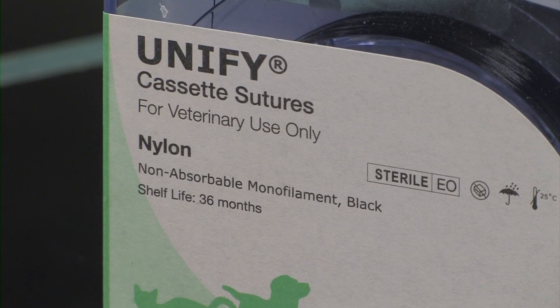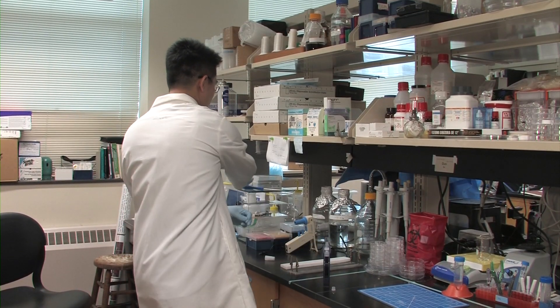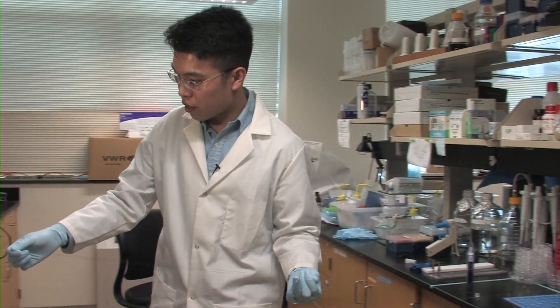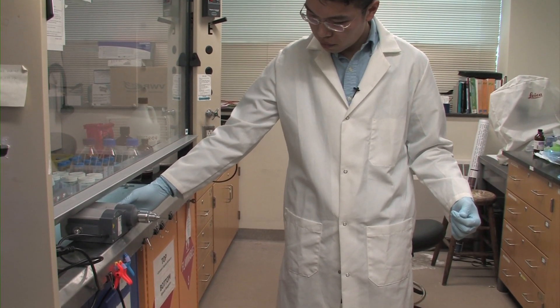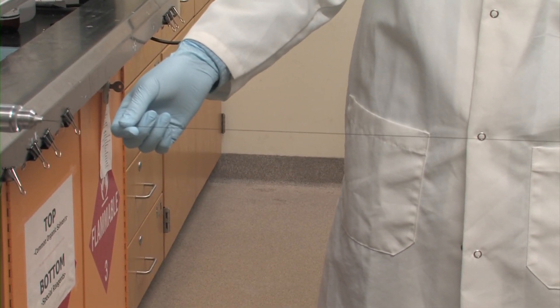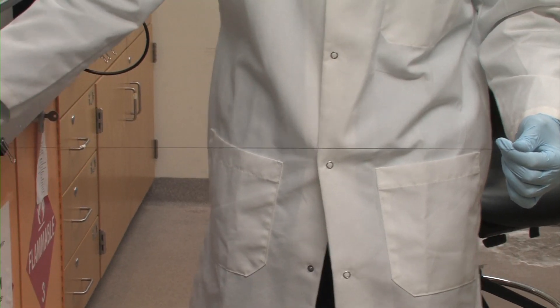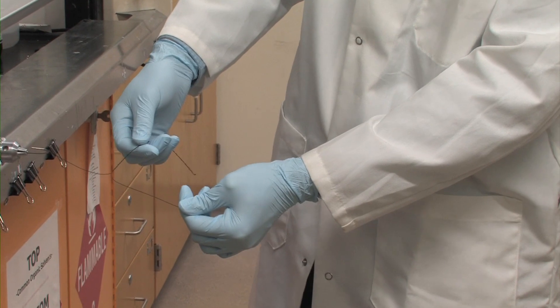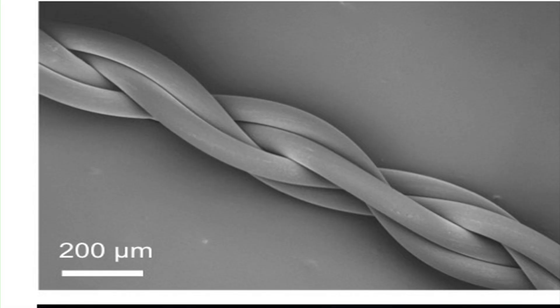The first thing we do is to use this clinical grade nylon suture. We take these sutures out and twist them using a motor. The suture will be twisted to form a double helix, which also generates some torque. To prevent the torque from releasing, we twist the sutures together again to make four strands twisted together, and then we make a knot at the end. This forms a stable four-string twisted thread.